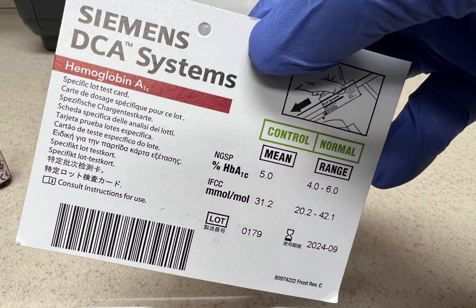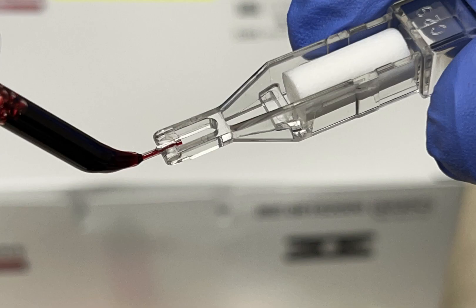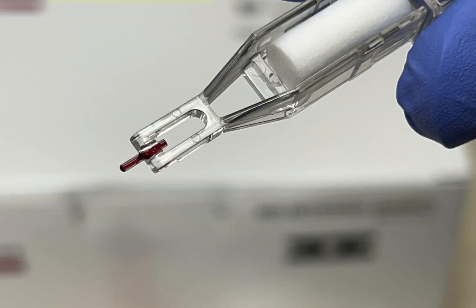Scan the normal green side of the card. Apply the normal control sample to the capillary collection device. Make sure there is no gap or overflow in the capillary device.